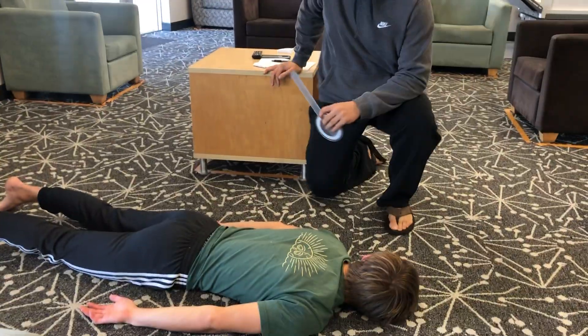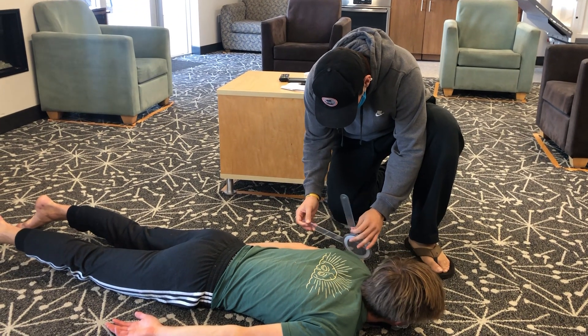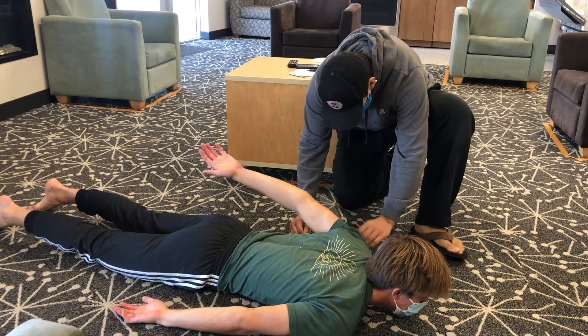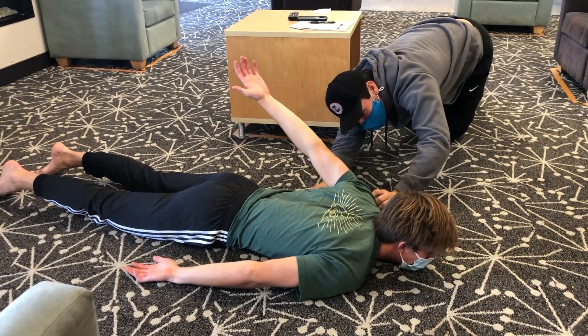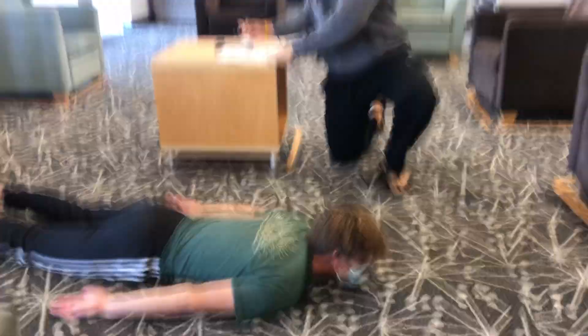Just relax, lay flat, and when you're ready, you can give me a good shoulder extension. The shoulder's a little tight. We've got a 55-degree angle there. Let me just write that down.